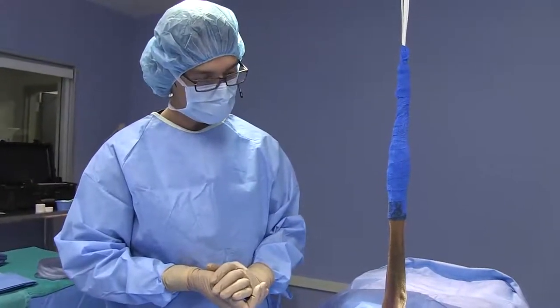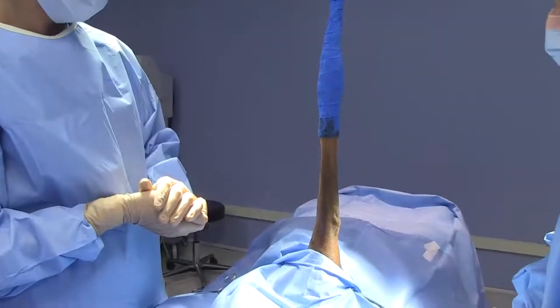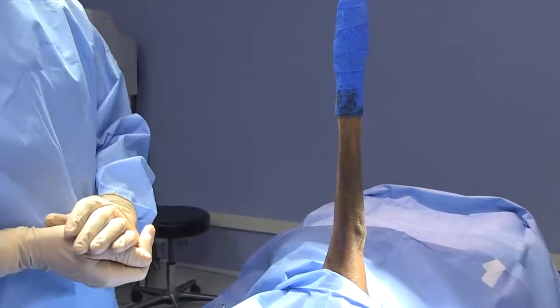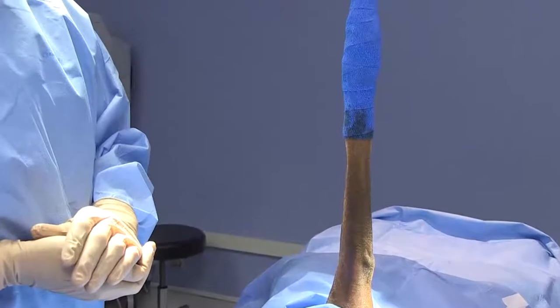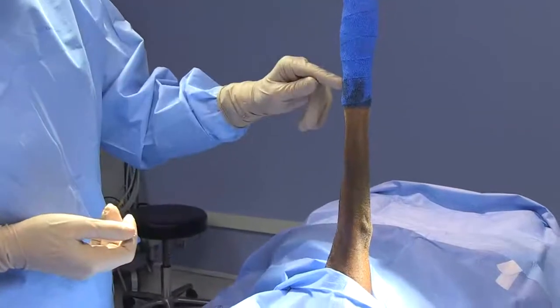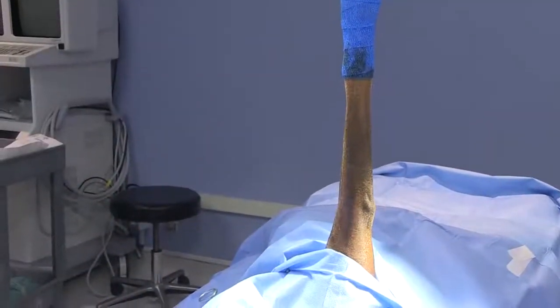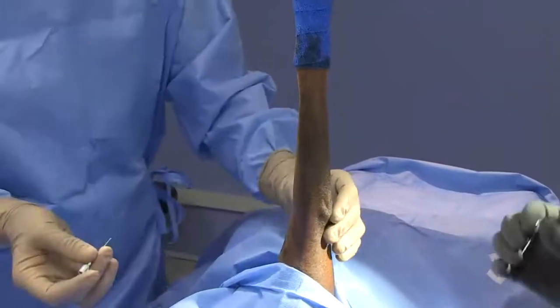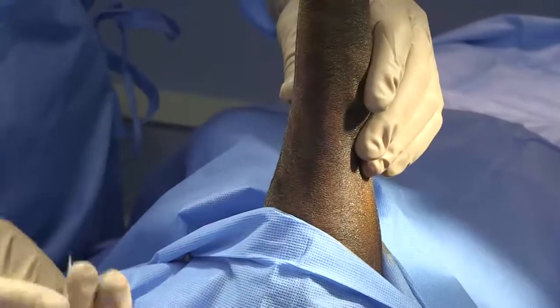Initially we need to assess the extent of the radius. When applying a linear external fixator, we like to do it in a far-near, near-far manner — placing our most distant pins first. To do that, we need to establish where the proximal and distal joints are. A handy way to figure out where the joint is is to use what we call feeler needles — basically just get some needles and delineate where the actual joint space is, giving you a much better frame of reference to place your first pins.